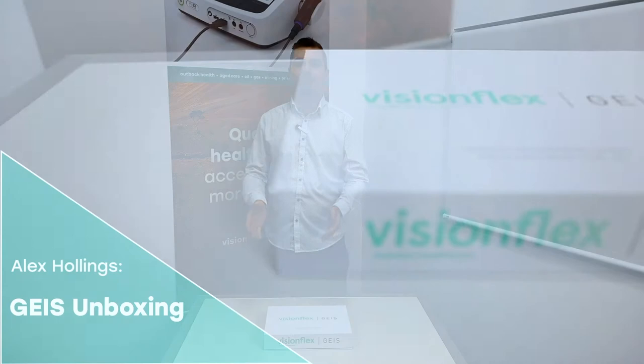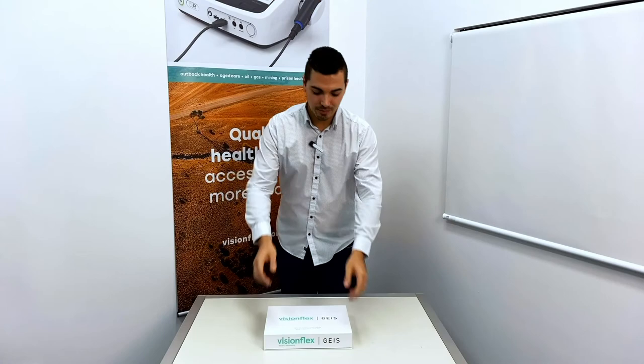Hi, I'm Alex and today I'm going to show you what's in the box when you receive your GEIS general examination camera.